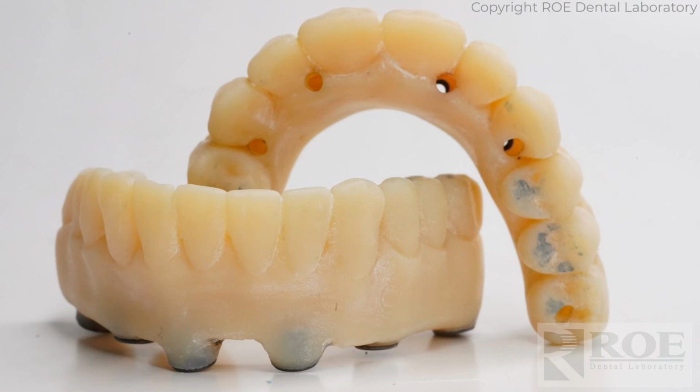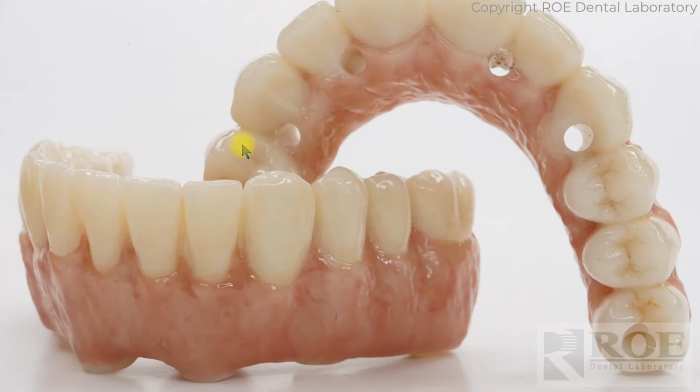This one came back from the doctor. This is a double arch, which you can obviously do. Just make 2 flasks and a bite as opposed to an opposing model. And from this, you'll try it in. You can do a reline impression underneath it if you need to capture the tissue. If for some reason we didn't meet the tissue, equilibrate carefully and simply physically return with a bite registration, and from that we go to a final restoration.